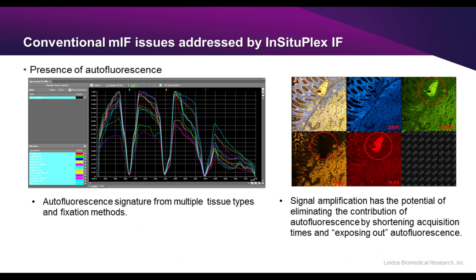Thank you. Now, is there a problem with eosin autofluorescence interference when multiplexing on an H&E slide? Great question, and I think maybe I wasn't as clear as I should have been for that part. But when we actually run the eosin, the H&E, on a multiplex fluorescence slide, we basically run our multiplex fluorescent assay first, capture that image. Once you're satisfied with that image and that image quality, then we would run the eosin, the H&E, afterwards, and then acquire your bright field image.